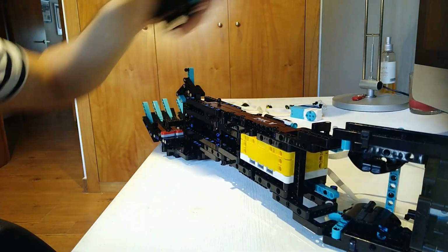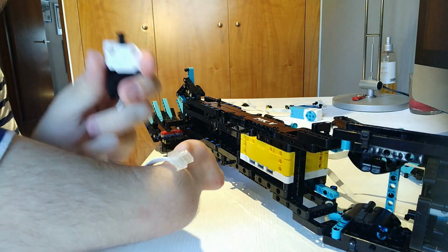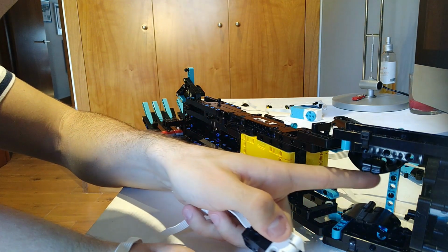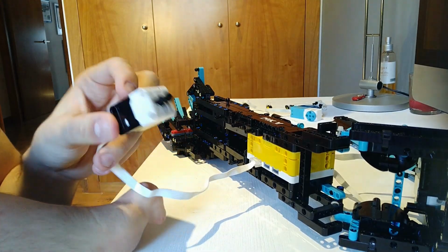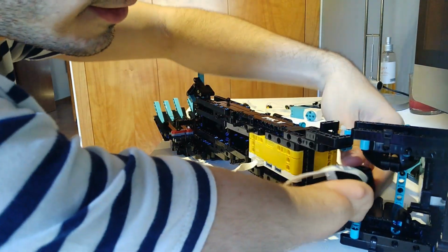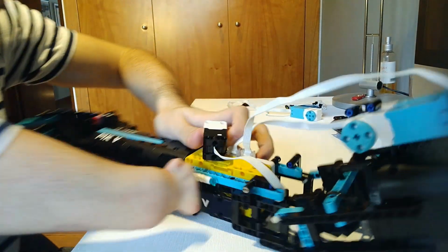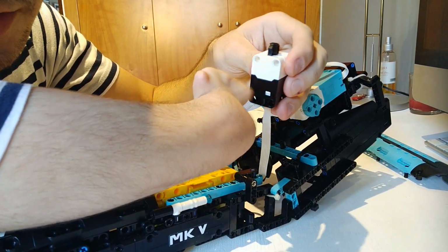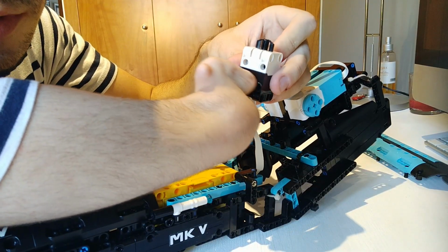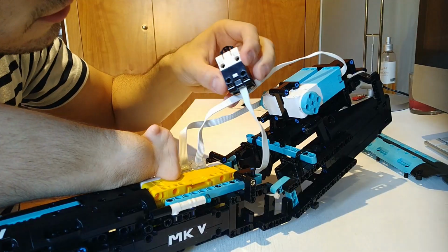Once you remove this bottom cover, you need to connect to the hole that's looking forward this pressure sensor that is going to be connected right here. Once you got the connection, you pull this thing through the prosthetic and grab it on the other side. Turn the prosthetic over and just so you can see it. These two small holes right here, you can actually see there's two holes on top right here and there's two on almost the center. So you need to connect these two to those pins right here. It should look like this.